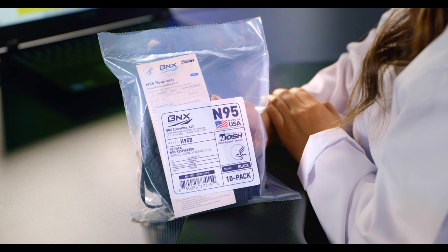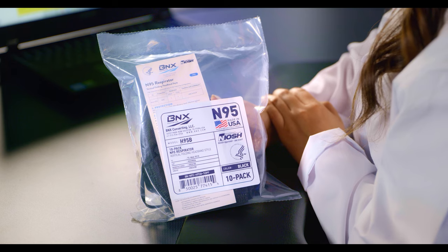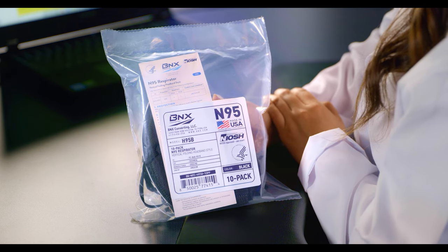Welcome to the Acumet channel. Today we're going to be testing the BNX 10-Pack N95 respirator, model H95B. This is a vertical bifold NIOSH approved respirator and we tend to find these a bit more comfortable and convenient to carry around than a cup style or tri-fold respirator.